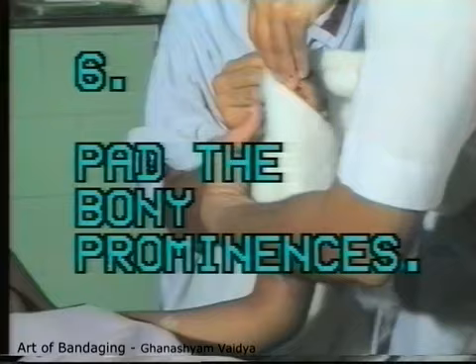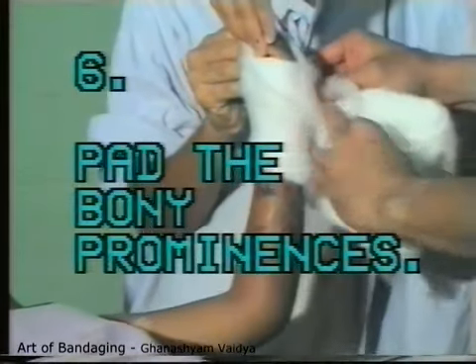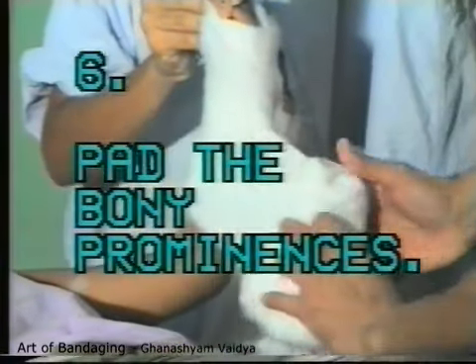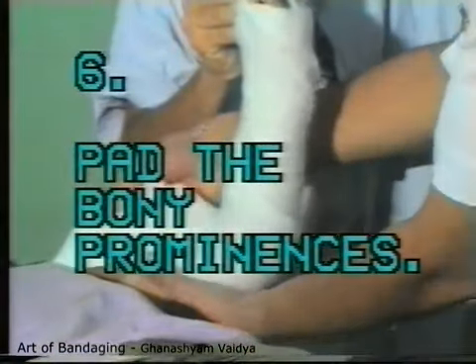If there are bony prominences in the area of the bandage, they should be well padded with cotton to avoid friction with the bandage. This is particularly important when a splint or a plaster slab is applied.